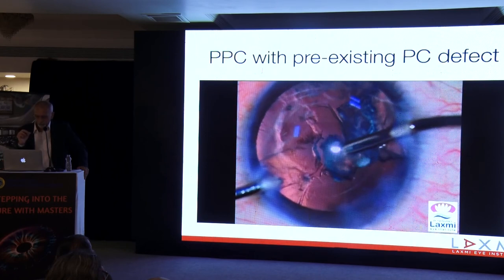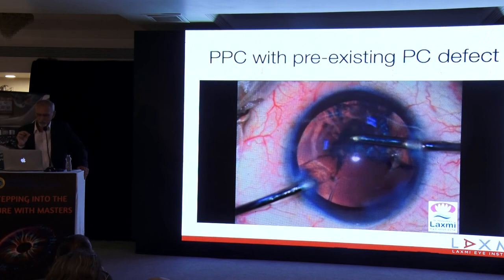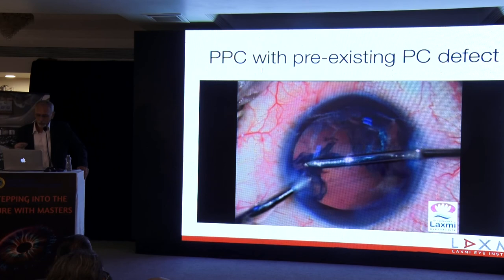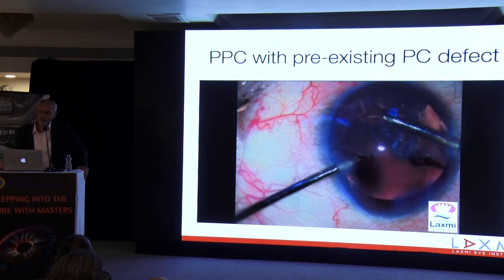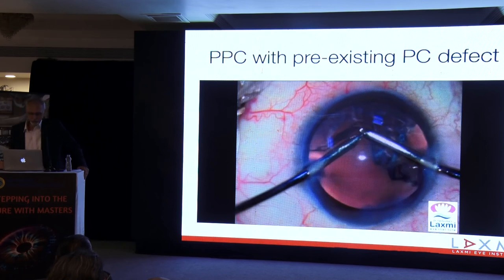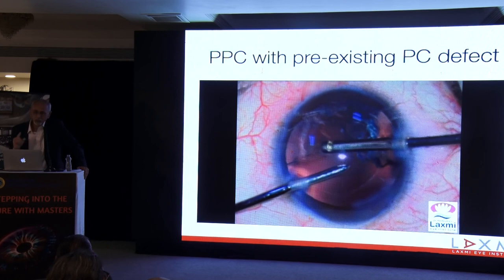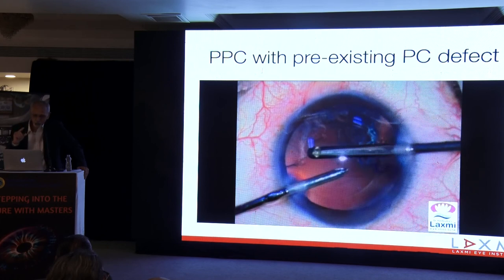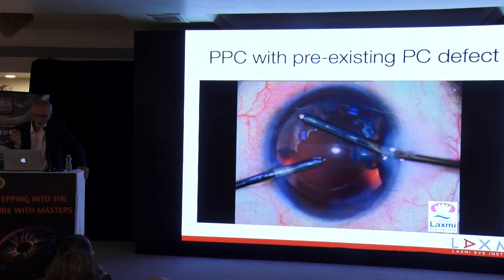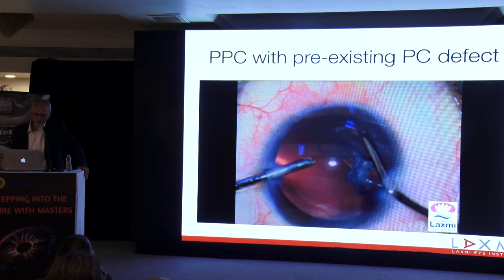At some stage when you feel that yes, the vitreous is getting disturbed, you go with a cutter. But as long as you are able to get most of this chunk out, your bimanual works better. This is when I go with the cutter. Cutter with very low vacuum and high cut rate. You just want to cut it there. You don't want to succumb to anything. And switch back to irrigation, I mean aspiration.